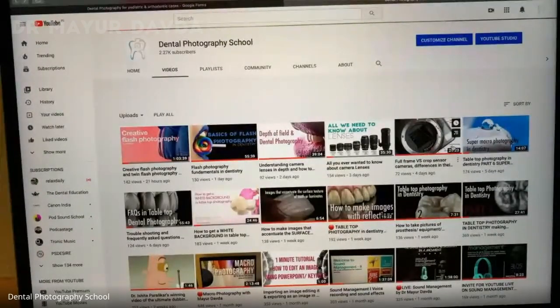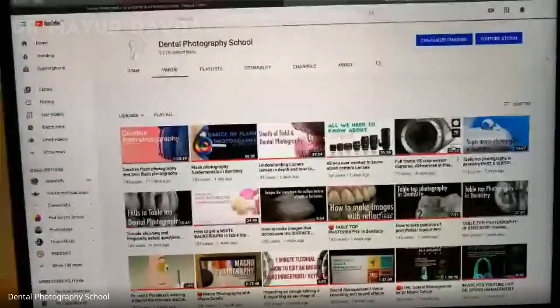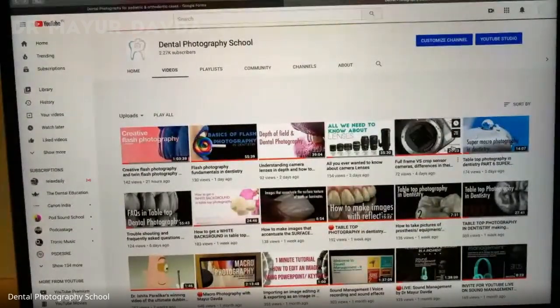Position of dentist while taking the picture. It's a very good question, Tamarai Selvan. It depends upon what picture you're taking. For maxillary quadrant, I usually stand from 11 o'clock till 2 o'clock position. For mandibular shots, I shoot from 7 o'clock. Most of the pictures, right? Extraoral, you can take it in front of the patient itself. Extraoral should not be taken on the dental chair.